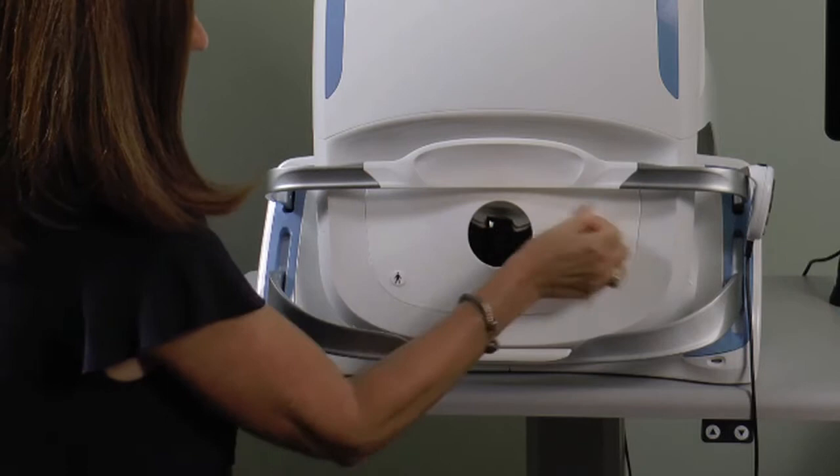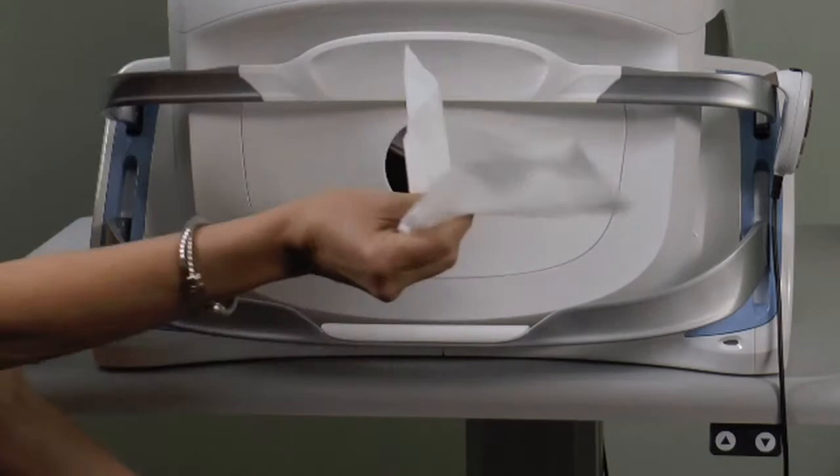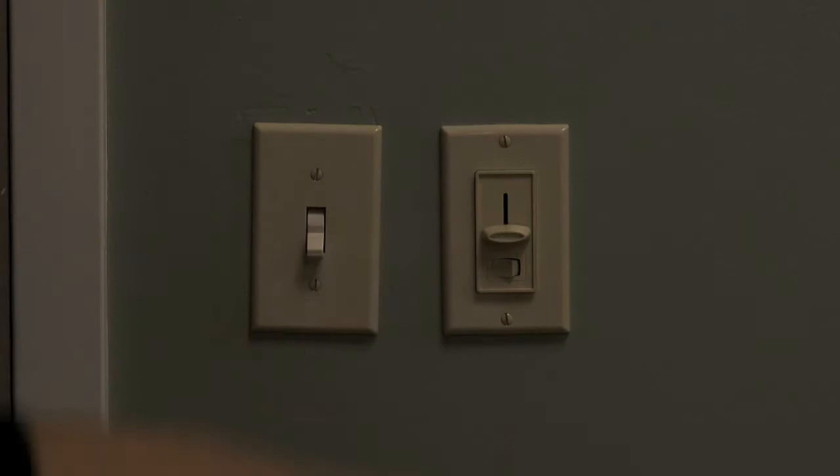Do not let the cleaning wipes come into contact with the inside of the instrument. Do not use tissues or other material to dry the areas that have been cleaned, as this could cause dust to collect on the scan head mirror and optical components, which may compromise image quality. Dim the lighting in the room to achieve maximum natural dilation of the pupils before attempting to capture an image.